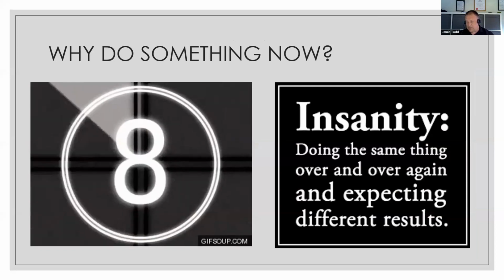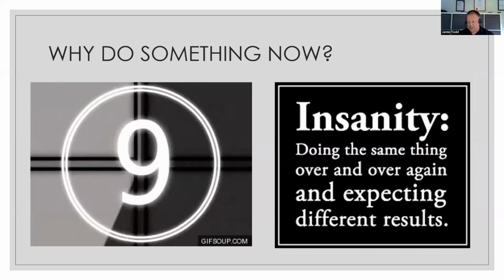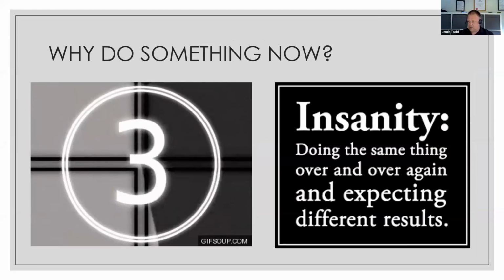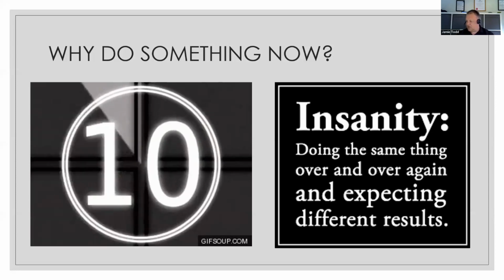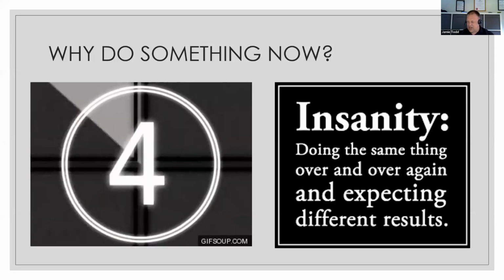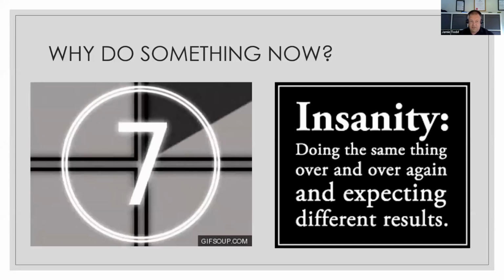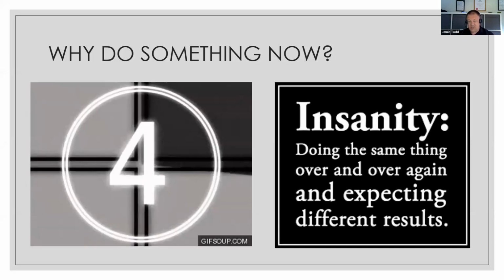So why do something now? Why change something at that sort of three shock count? It's because the true definition of insanity is doing the same thing over and over again and expecting different results. If our maximum shocks, by three shocks, haven't done anything, then any expectation that we just keep delivering shocks and something different might happen is maybe not a likely thing to happen. So now is really the time we need to start thinking about what can we do, how can we improve it, how can we change something. And we do see pre-hospital teams at 10, 15, 20 shocks, having changed nothing.